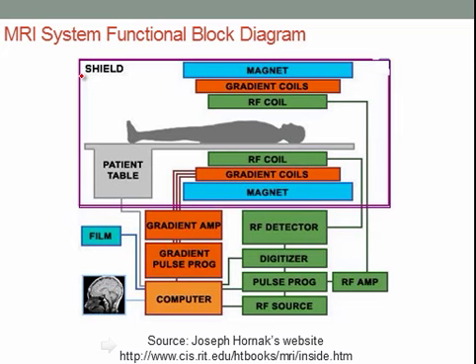You don't walk into an MRI room and see copper on the walls, but behind the sheetrock is copper everywhere, on the walls, the ceiling, and the floor. That's called a Faraday cage because it prevents electromagnetic energy from getting into the room or exiting the room.